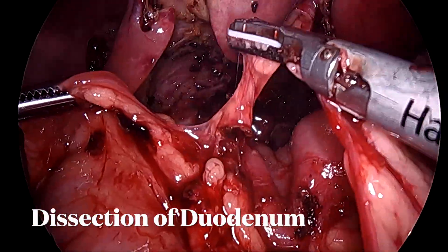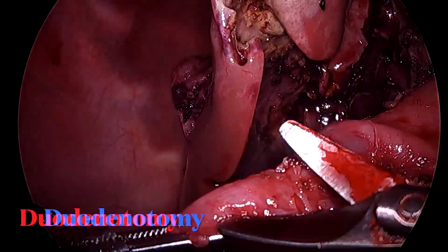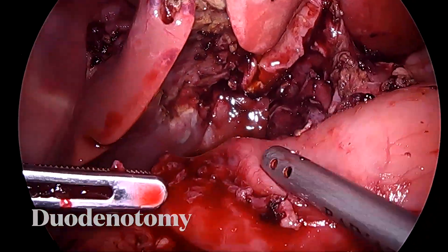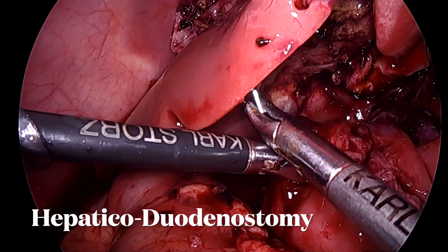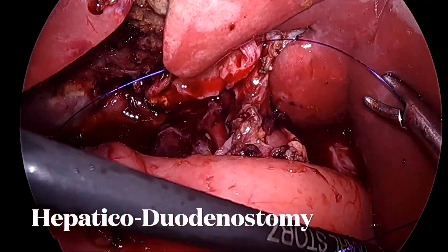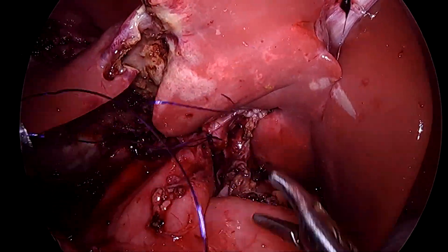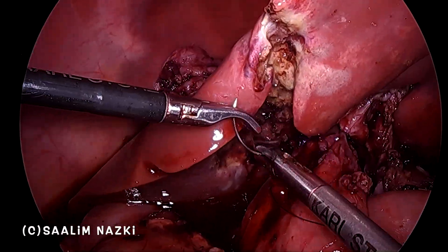Once we had dealt with the cystic part, we started mobilizing the duodenum. It is very important to make the duodenotomy — the site of anastomosis — as far as possible from the pylorus, preferably in the D2 part of the duodenum. Duodenogastric reflux is one of the major complications of hepaticoduodenostomy, and opponents of hepaticoduodenostomy cite this as one of the biggest reasons for preferring hepaticojejunostomy.